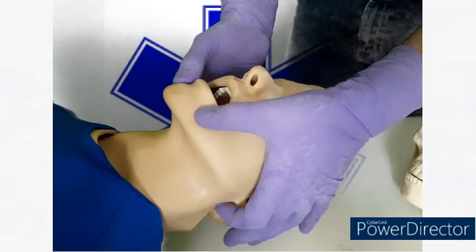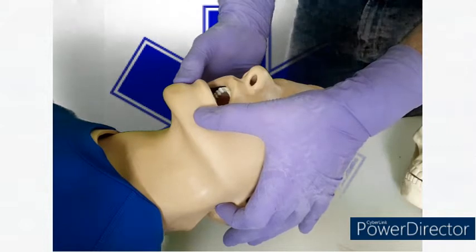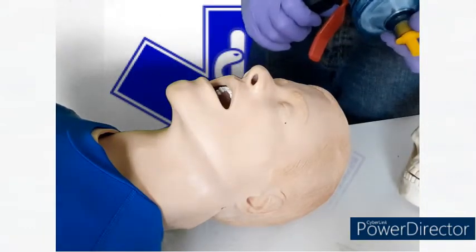If I do identify anything in there, I could use postural drainage by rolling the patient away from me to allow anything to drain out, or even the recovery position, or I could use my manual suction equipment, which we're going to have a look at now. So here is an example of manual suction equipment.